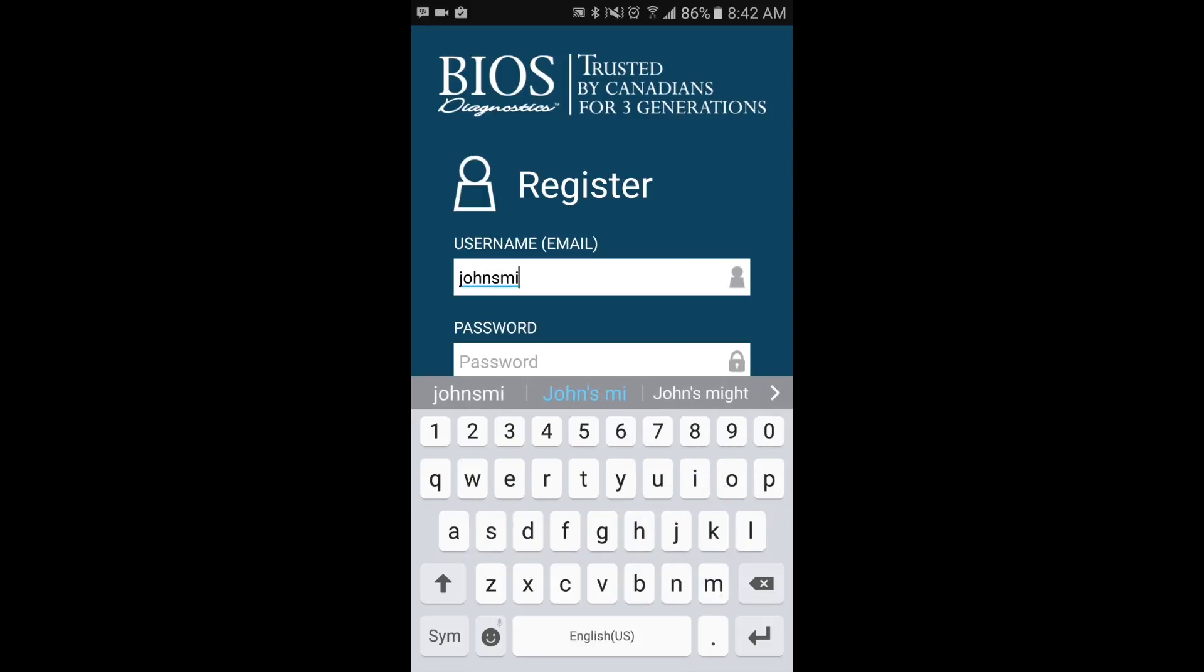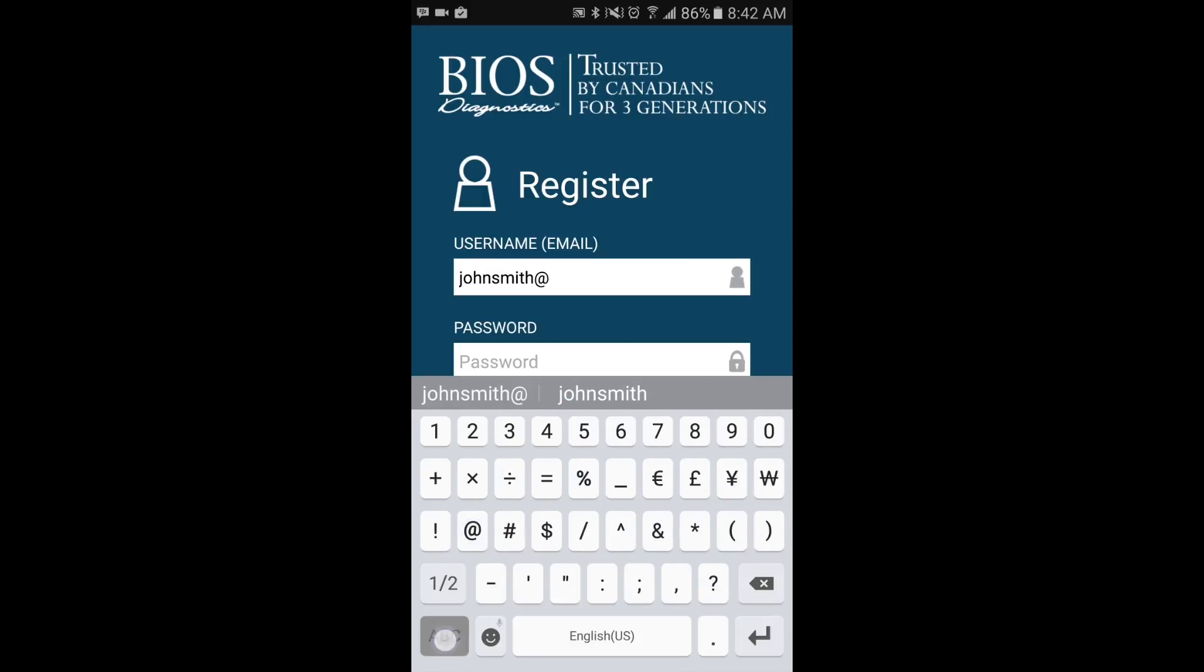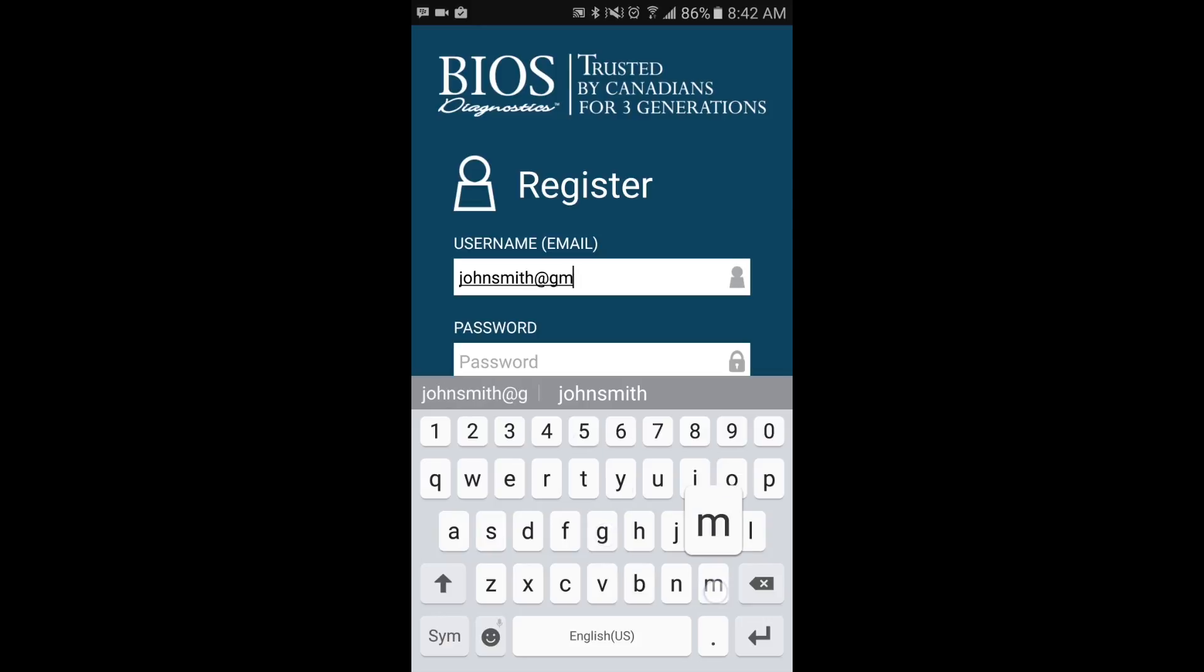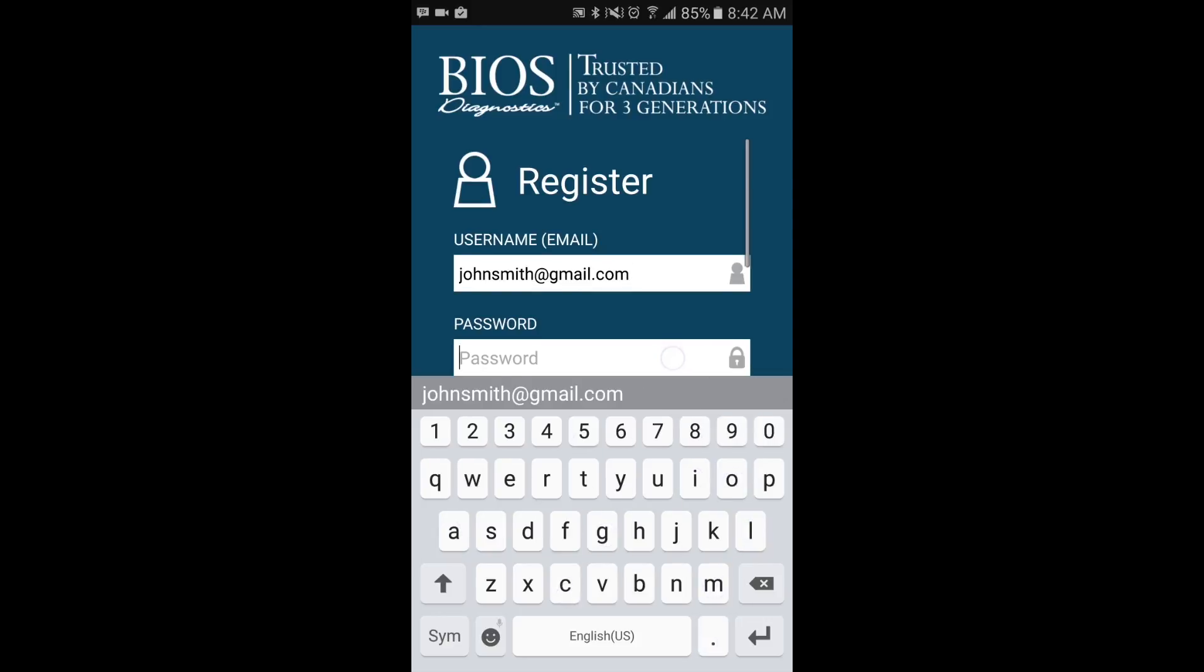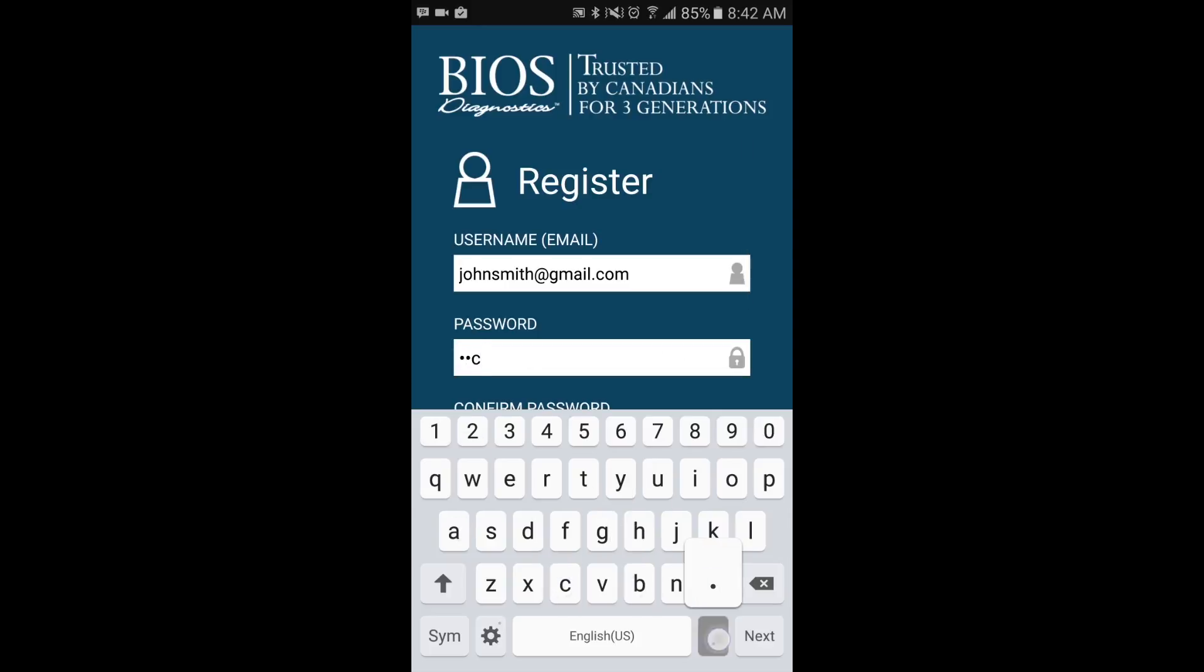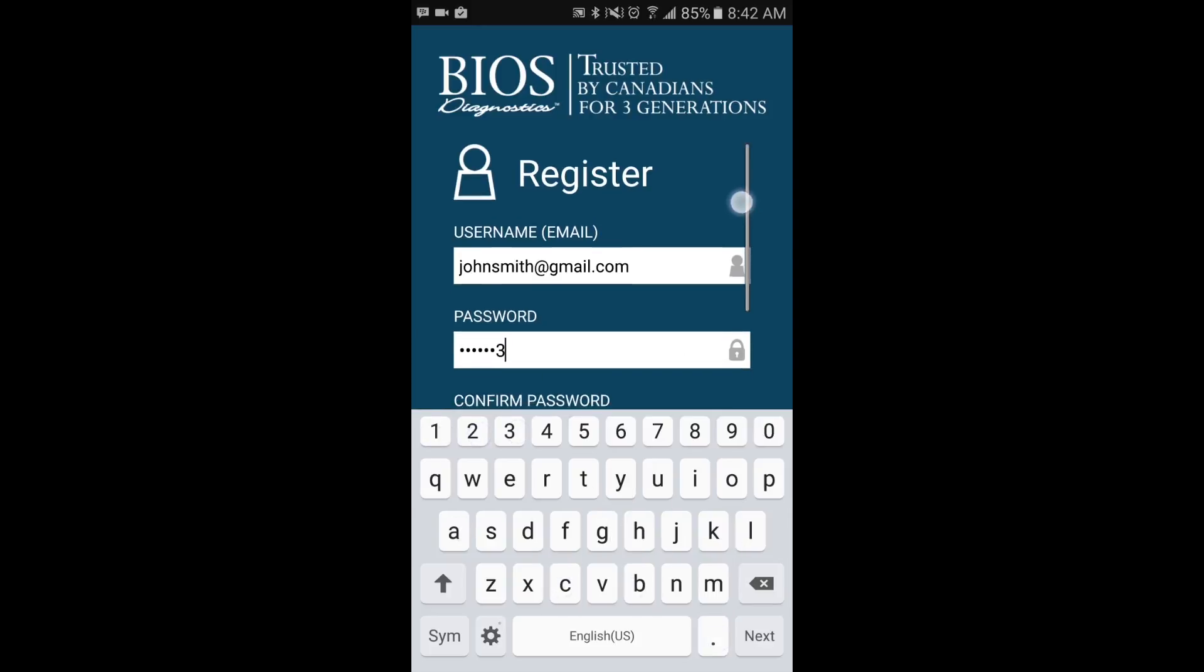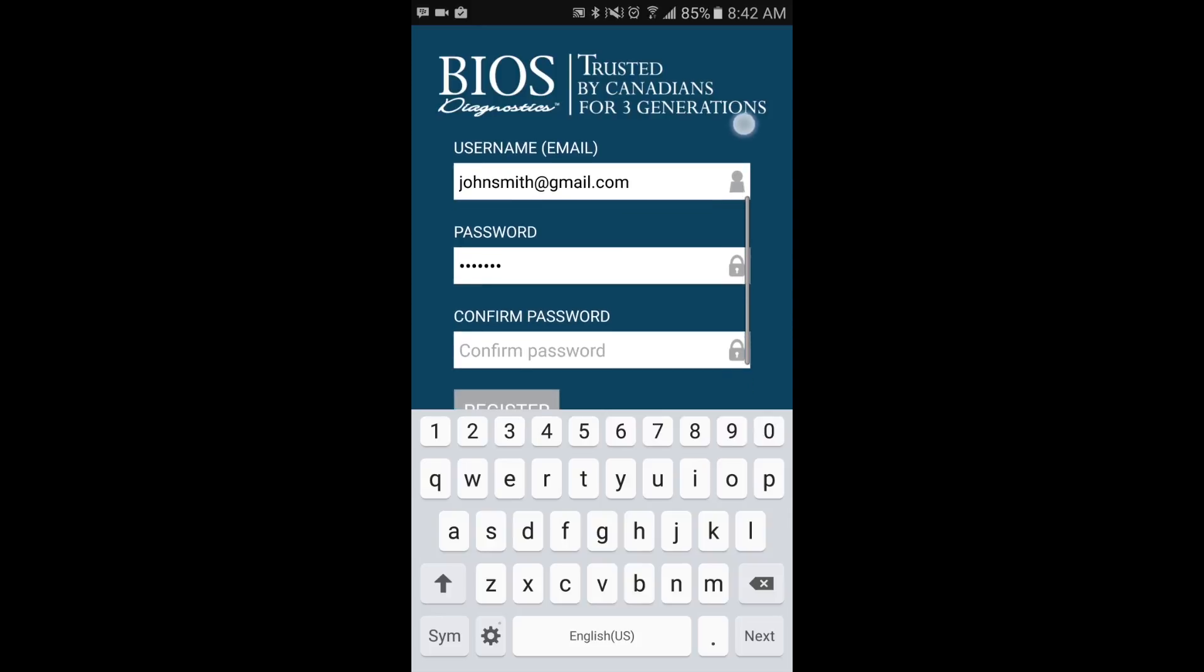Then enter your email that you use on a regular basis, followed by a password of your choice. Make sure that whatever password you choose will be one that you remember, as you will have to enter it again in the future.